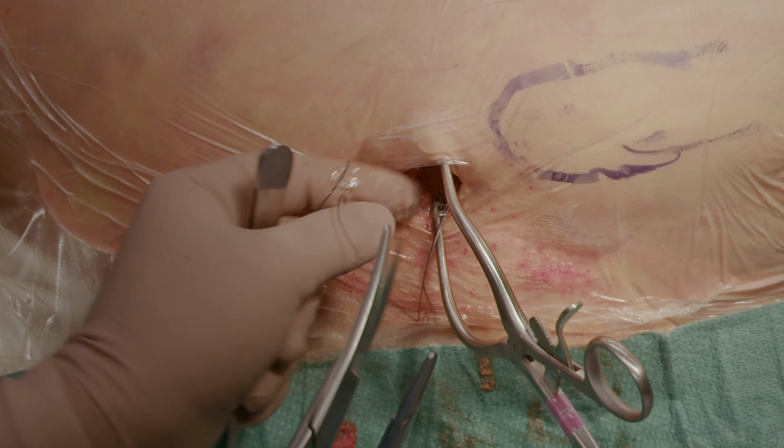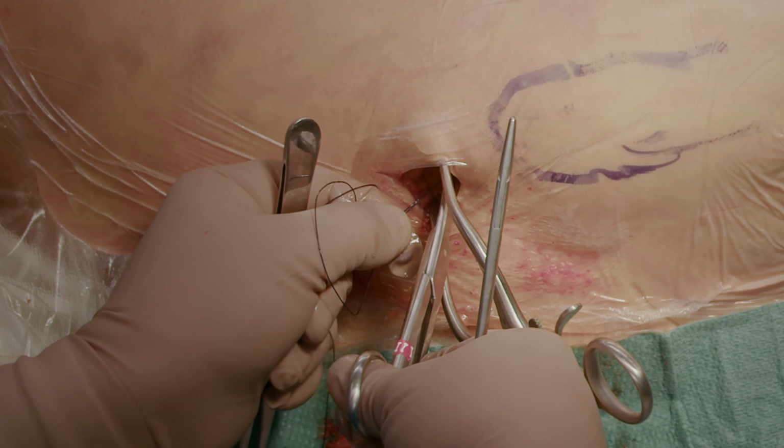Then absorbable sutures such as 2,0 Vicryl in the subcutaneous layer.